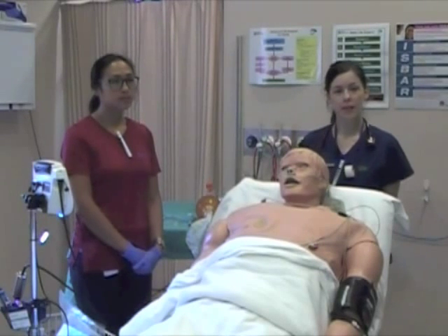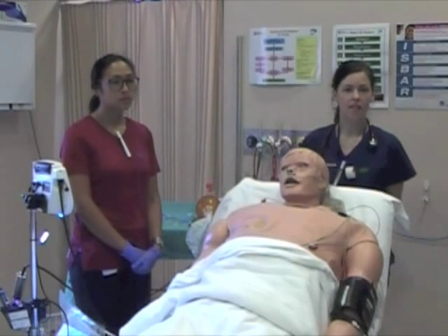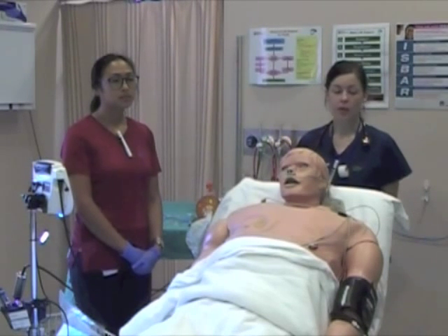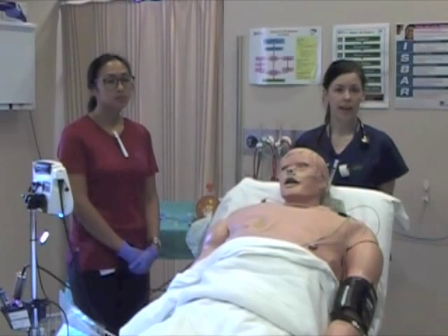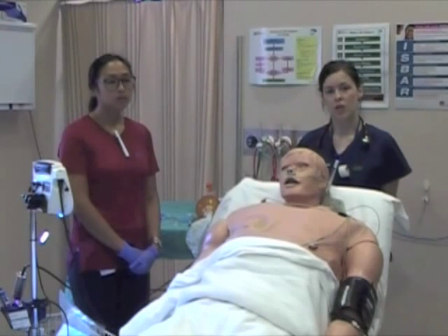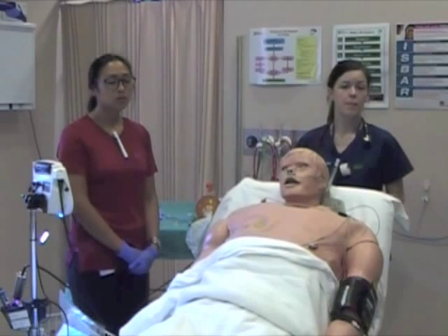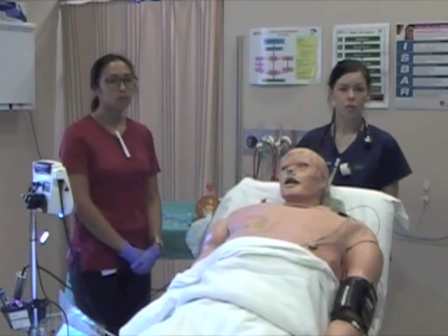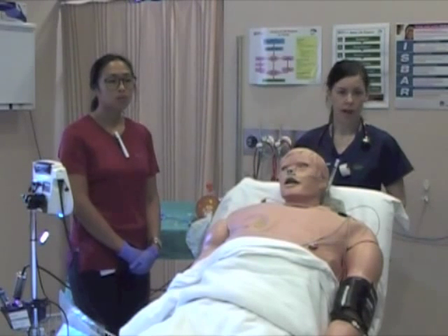He has a difficult airway because he's become agitated and he's fighting his oxygen mask and pulling it off. To optimise pre-oxygenation prior to intubation, we need to settle him down, and we're going to do that with ketamine as a procedural sedation, essentially. Then we're going to allow for about 3 minutes of pre-oxygenation, and then we're going to move into intubation. Because this can sometimes deteriorate quickly, we're also going to be ready to tube immediately after the ketamine goes in. So we're going to set up our entire airway plan beforehand.